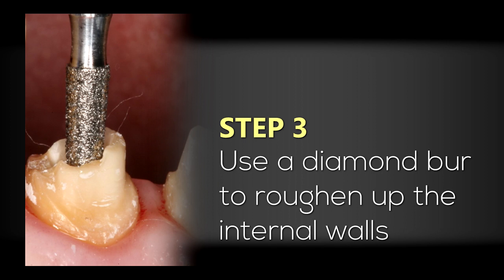Before cementing the post, I'm going to use the diamond bur that comes with the Siropost kit. This is used to roughen up the walls of the internal aspect of the root system to give more mechanical adhesion with our post cementation.